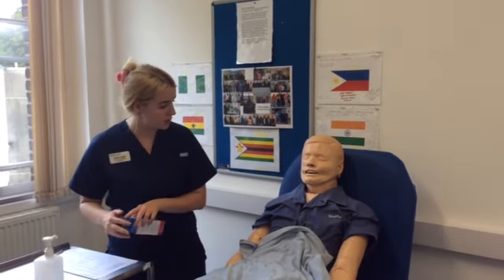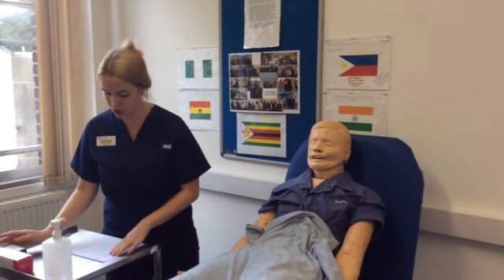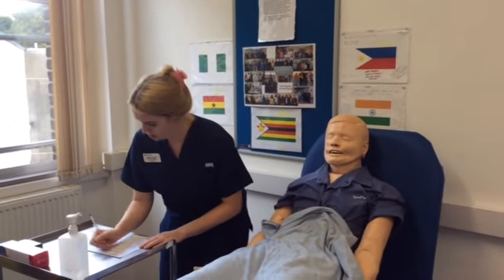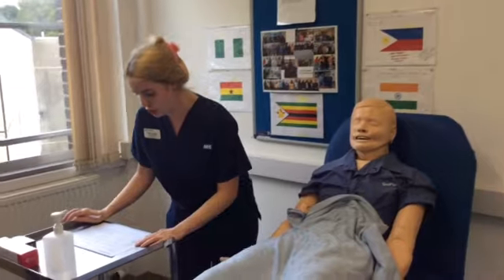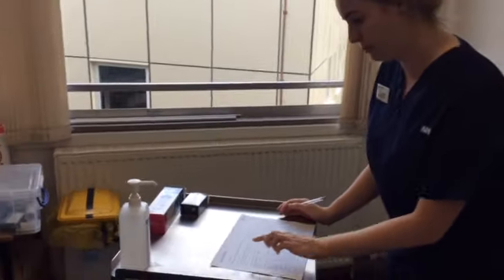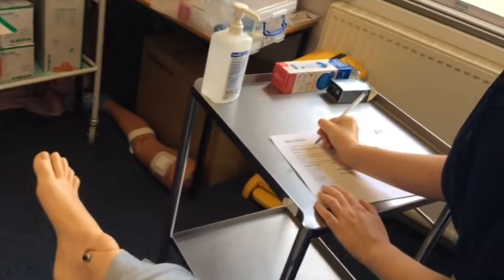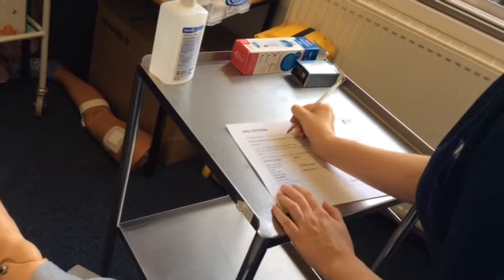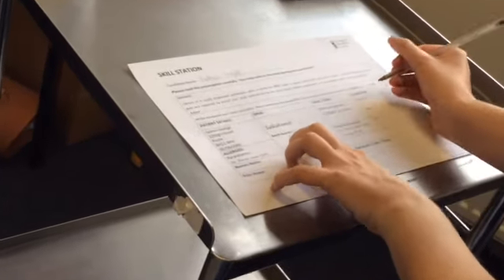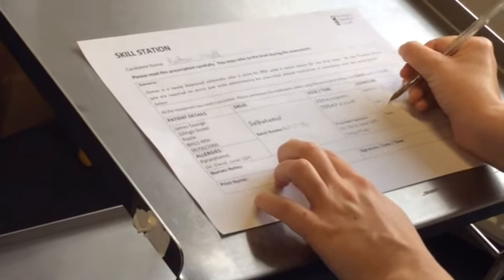Would you like me to do anything for you while I'm here? No, I'm fine, thank you. Okay, I'm just going to do my paperwork then. So now I'm going to complete my drug chart. So first I'm going to write my name at the top. I've already written the batch number here, and I'm going to sign that I've given the patient his medication, date and time it.